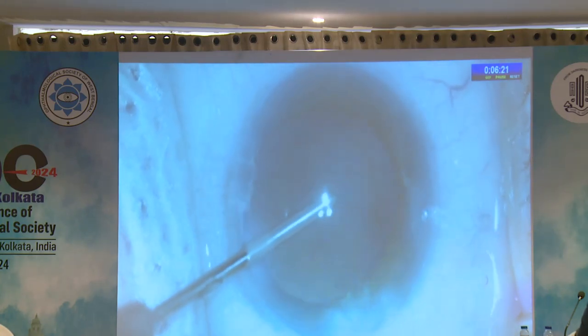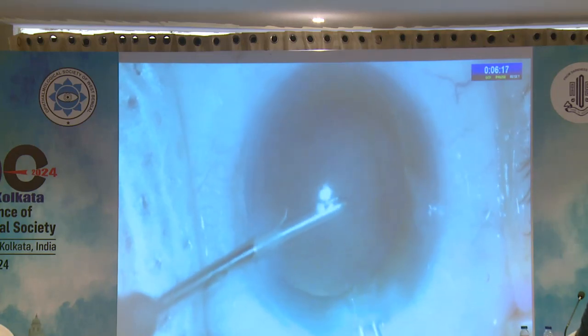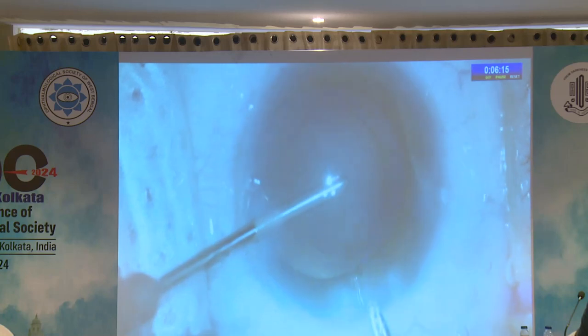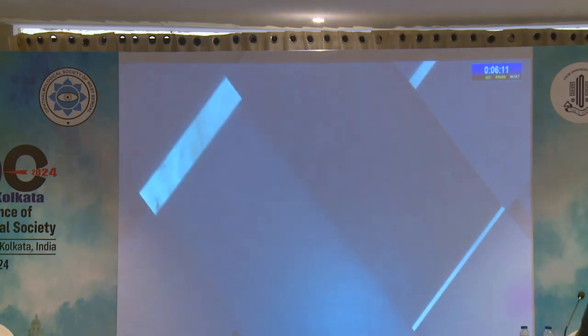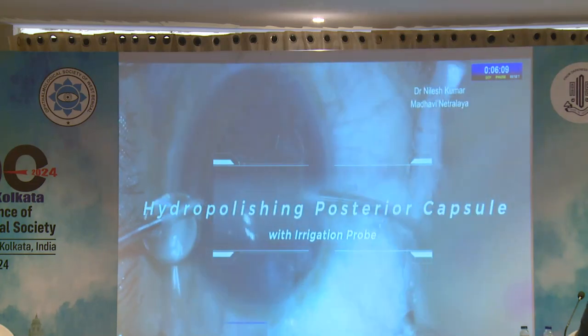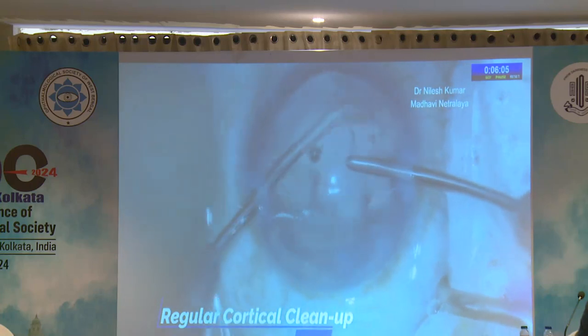But now as you can see that it is not coming out, so what we can do is grab a Macpherson forceps and try to grab the small piece and pull it out and stop the irrigation. Now another thing is to hydro polish the posterior capsule.